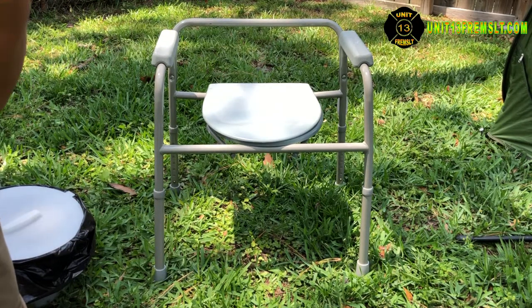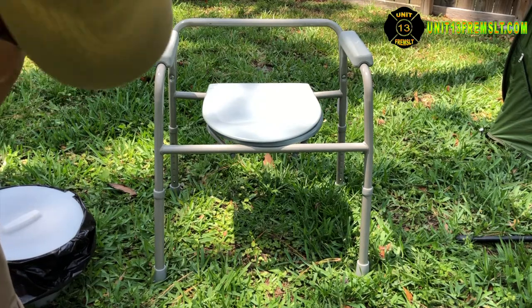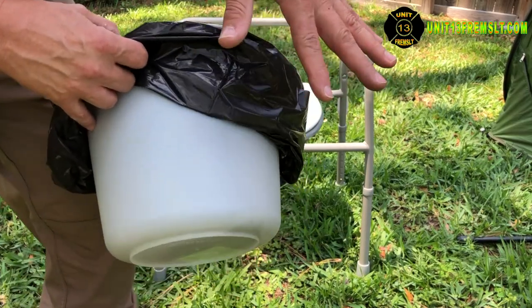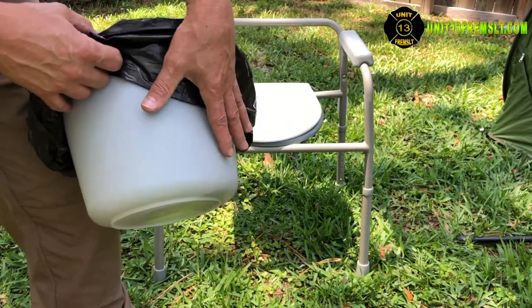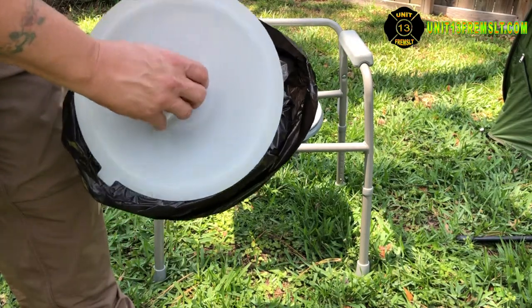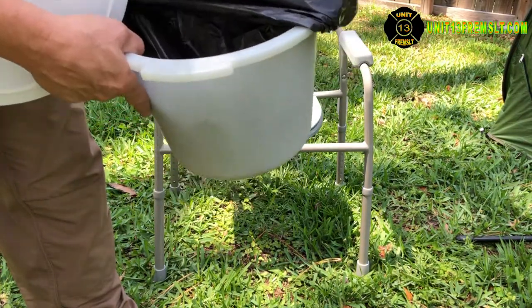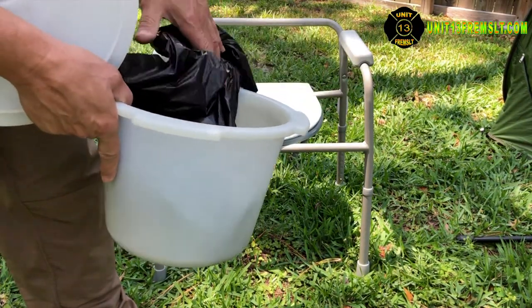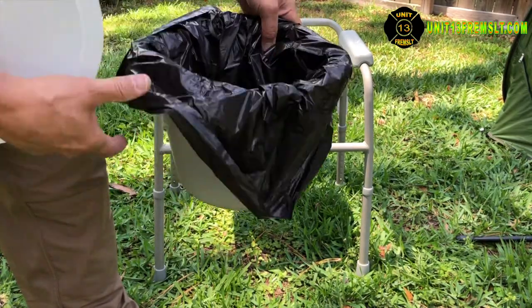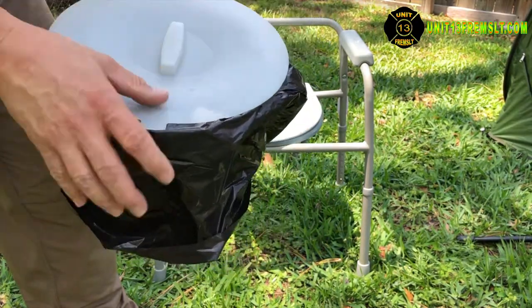The important thing to remember is that if you use a bucket like this, make sure it has a liner in it. That way, cleanup is simply a matter of pulling the bag out and putting in a new one. If you run out of bags, it's better to switch over to the drywall bucket method.